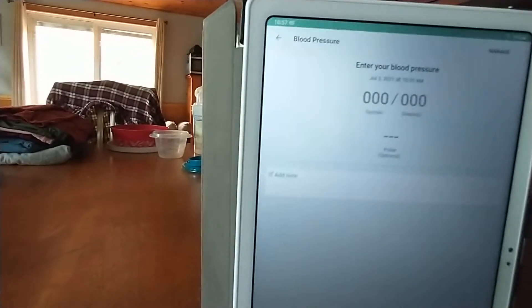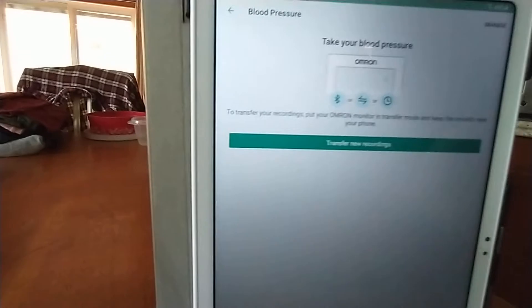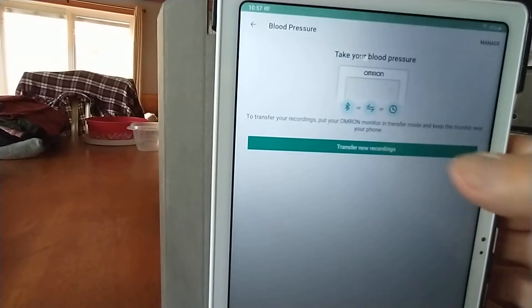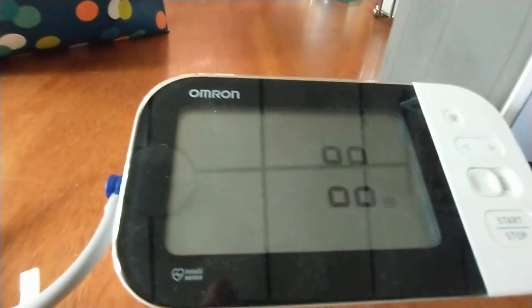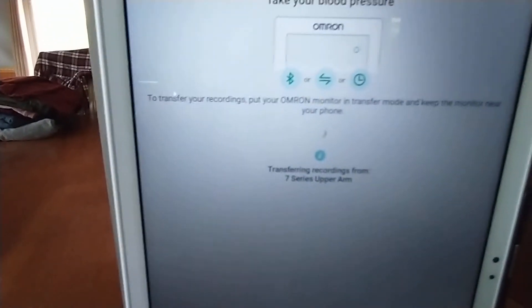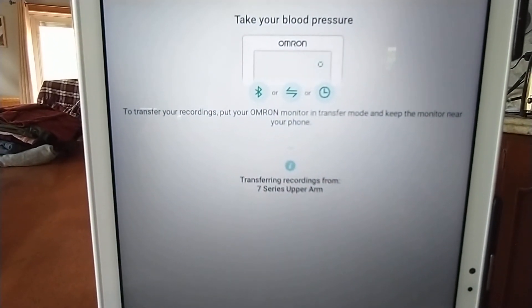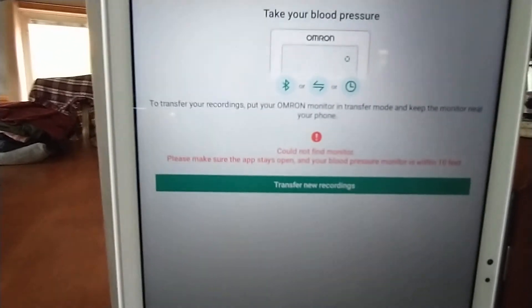So we go back to the original screen, where I want to transfer blood pressure readings from the monitor to the phone. You now hit 'Add Blood Pressure,' then 'Transfer New Recordings.' So watch what happens — this is the state of the blood pressure monitor. Watch the message that comes up: 'Could not find monitor.' So how do I transfer my readings?